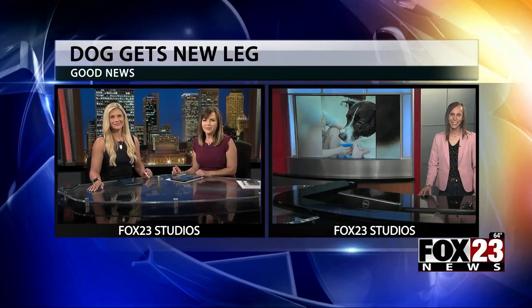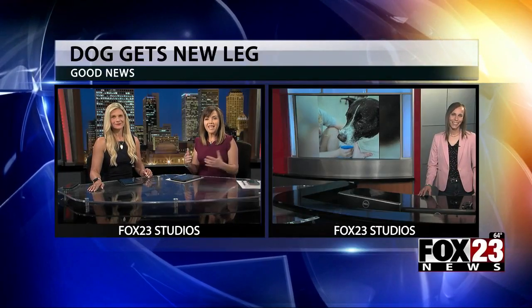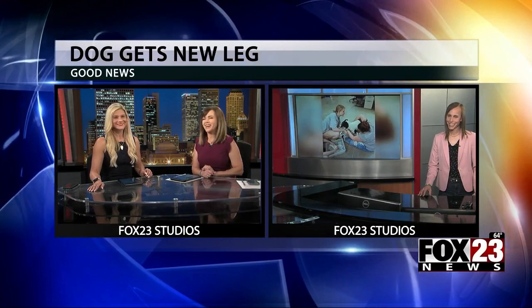That's some good news. A student at Broken Arrow's Vanguard Academy is getting a former shelter dog a leg up in life by 3D printing a prosthetic leg. This is really wild. Fox 23's Katherine James joins us live in studio with the story of Cain the dog and the student trying to help.